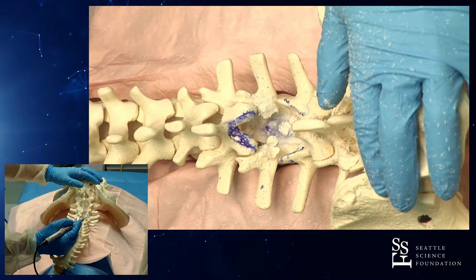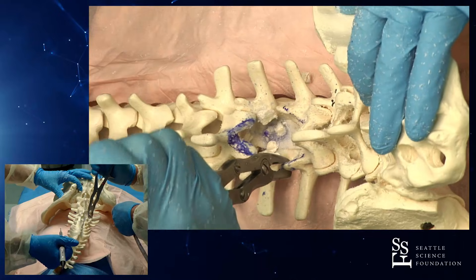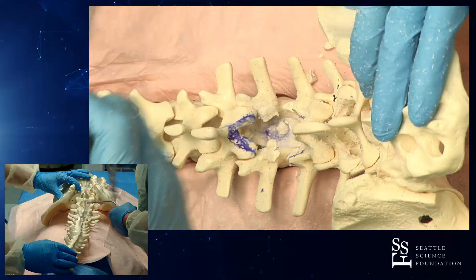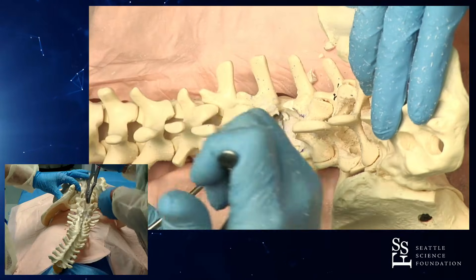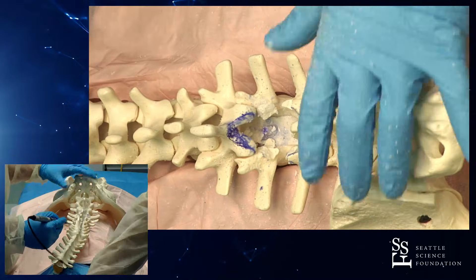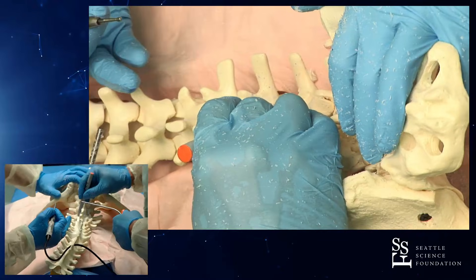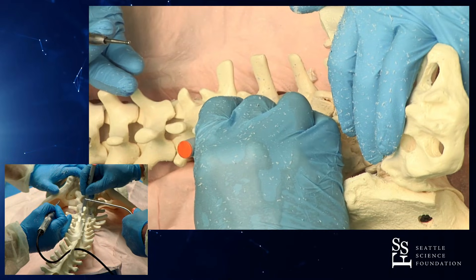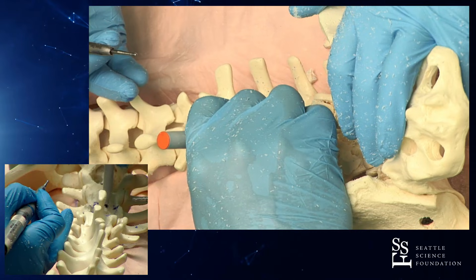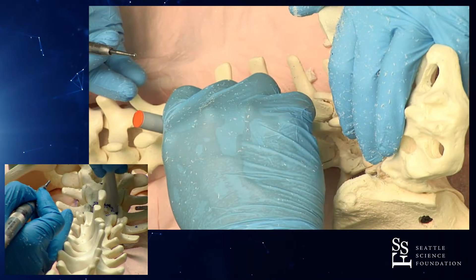In this case now, we want to do our W-cut to fulfill our facetectomy — literally a pedicle-to-pedicle resection. Going to flatten out the superarticular processes, the big osteophytes. The goal here is again a pedicle-to-pedicle decompression. Just to show you the W again: a horizontal cut through the tip of the superarticular process, a vertical cut along 50% of the articular surface. Coming along here, this opens up the lateral recess, opens up the canal.